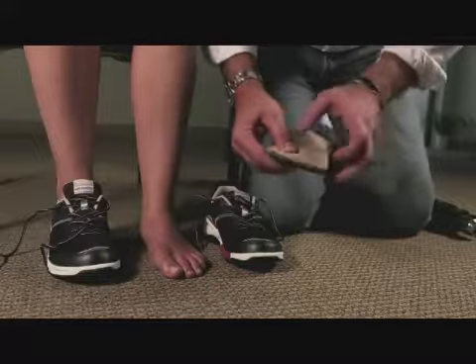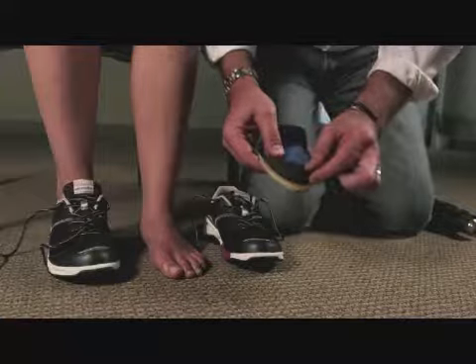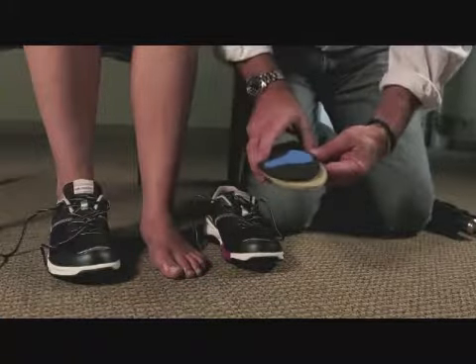In this case it's the correct size. If it were to be slightly long, we can trim using the trim lines in the forefoot of the full-length orthotic.